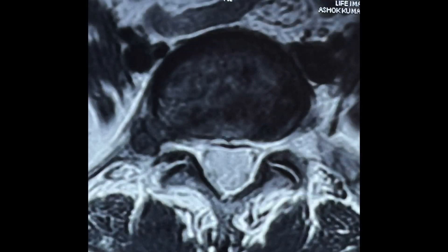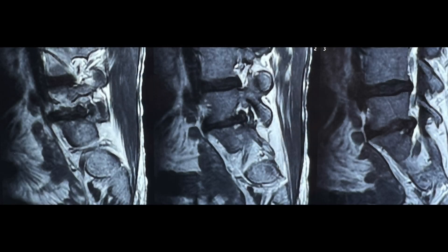As you can appreciate on the axial image, there is a large right extraforaminal disc fragment pressing on the exiting nerve root.